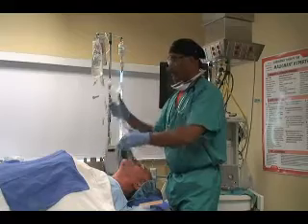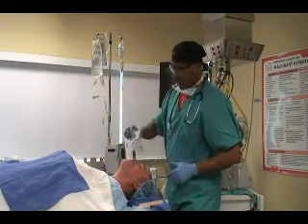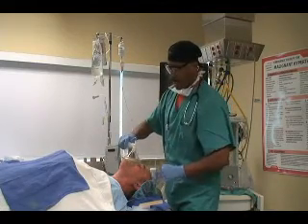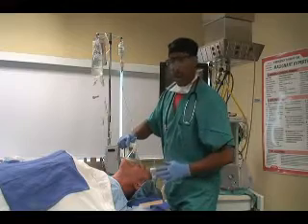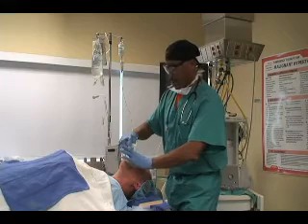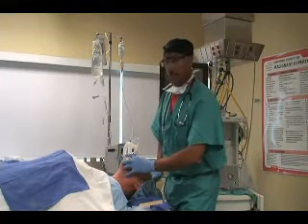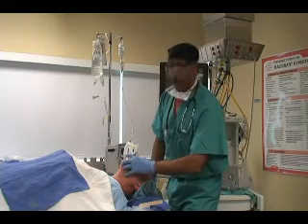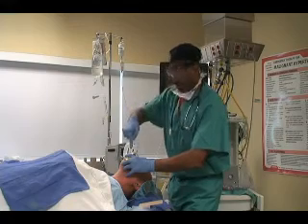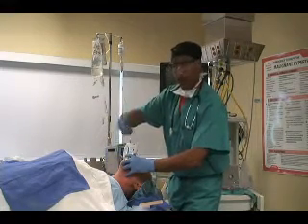From here, I'm going to take our mask, which has been inflated already, and I'm going to place the apex of the mask on the bridge of the patient's nose, and it just covers towards the bottom of the chin. I'm going to place my fingers in a C position, the thumb being across the bridge of the nose, the fingers across the bottom, the chin portion, and the other three fingers are going to go on the jaw. And from here, downward pressure with the C and a little upward pressure with your fingers.